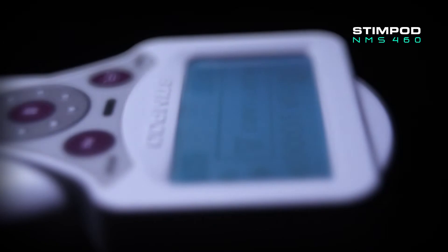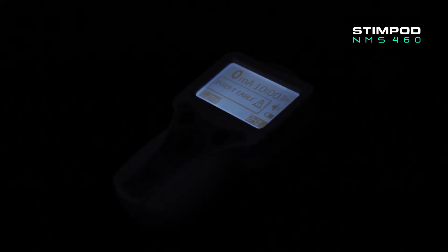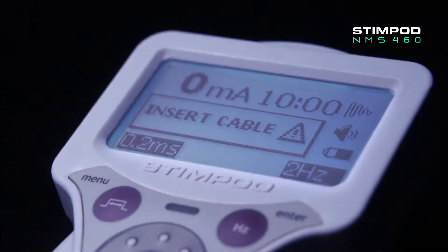The StimPod NMS 460 is a portable handheld nerve stimulation unit which offers non-invasive pulsed radio frequency therapies, which have been proven to successfully treat a vast array of neuropathic and chronic pain conditions, offering real and lasting pain relief to patients, restoring the quality of their everyday lives.